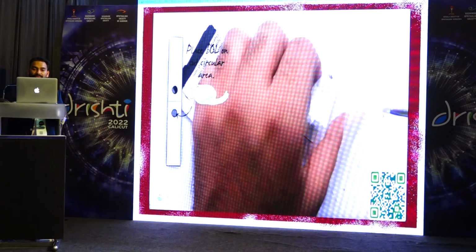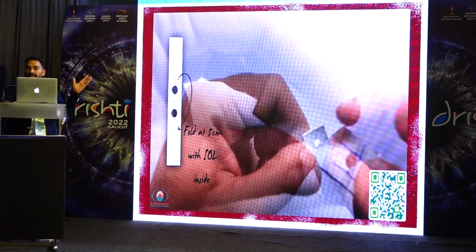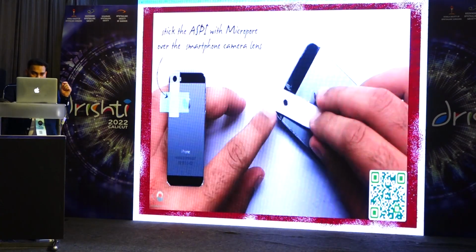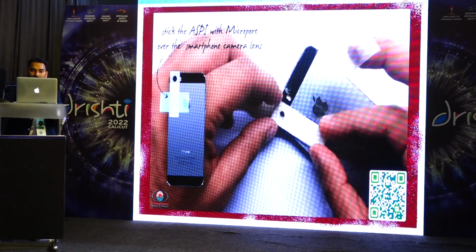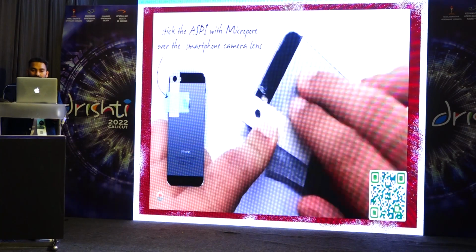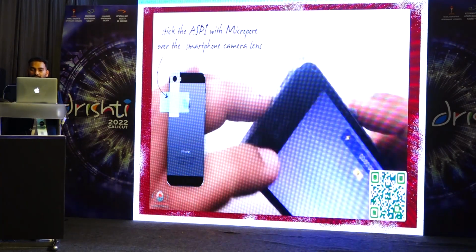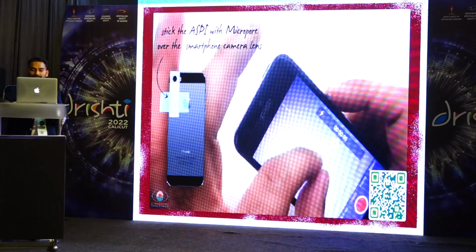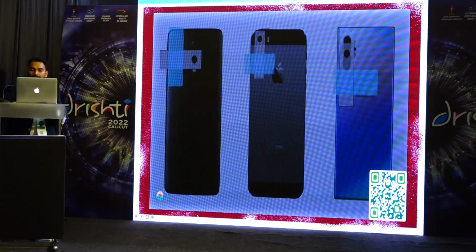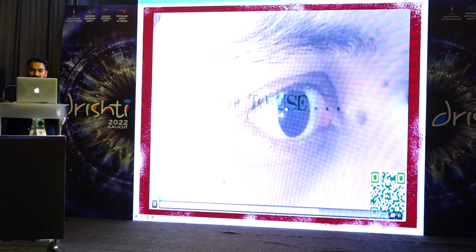I've been putting 15 to 20 to take anterior segment images. With 15 you will get a wider field. With 20 or 25 you get more focused image quality. Like over here, you can just attach it with a micropore or a sellotape, and now your phone camera has just turned into a macro lens, and it will take images of the eye. And this can be used in all types of phones, whether it be central or peripheral.